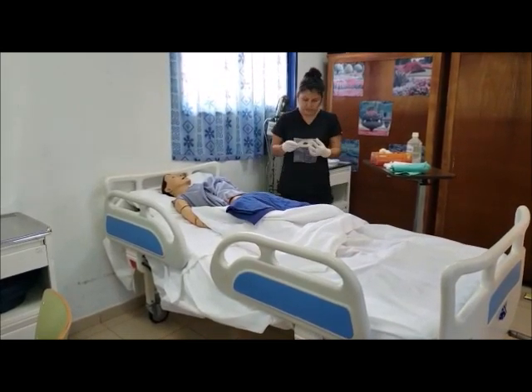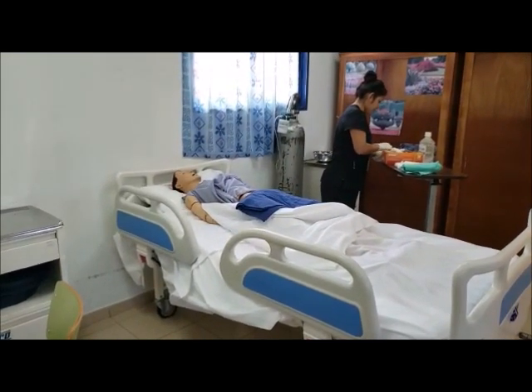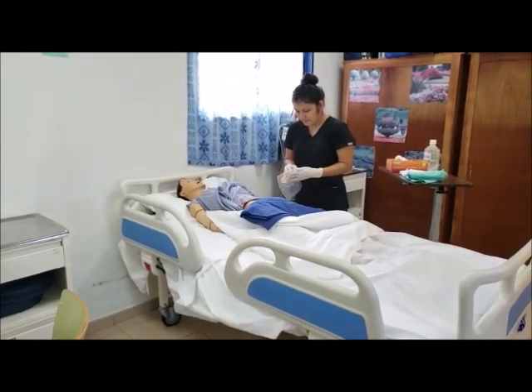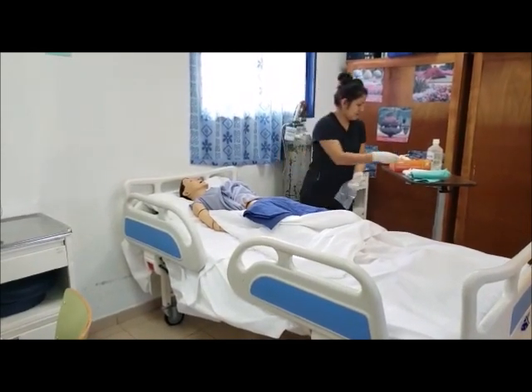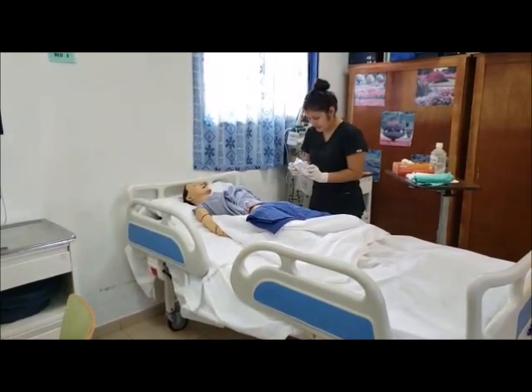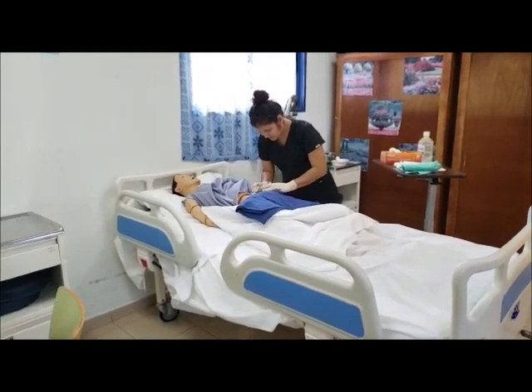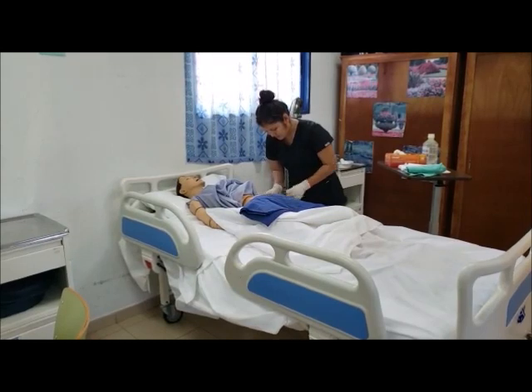Apply a ring of skin barrier paste to the opening of the pouch. Alright, Mr. James, are you ready? Remove paper from the outer ring. Center the pouch over the stoma and apply to clean and dry skin. Smooth edges of adhesive to skin. Close and secure end of pouch with a tail closure if applicable.